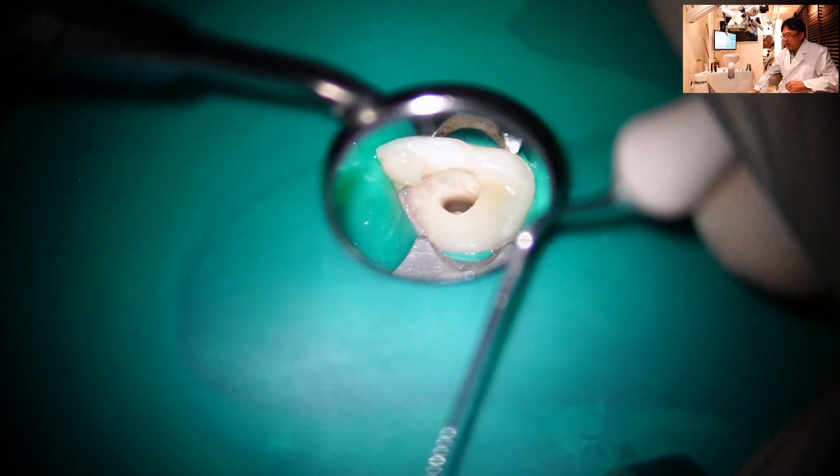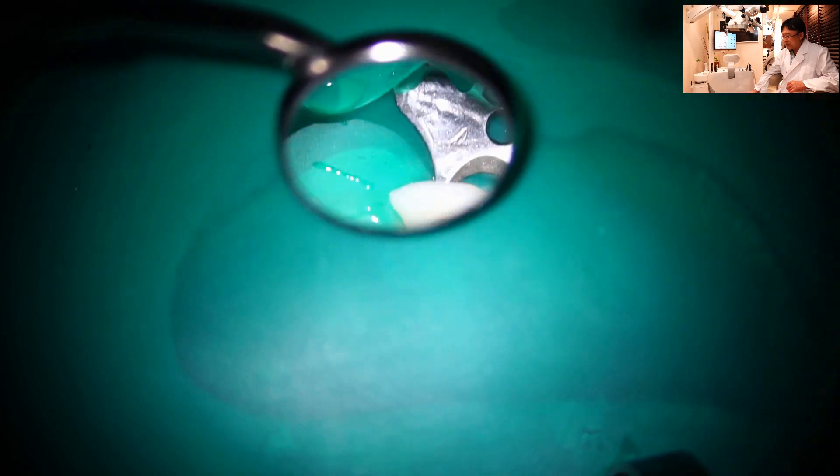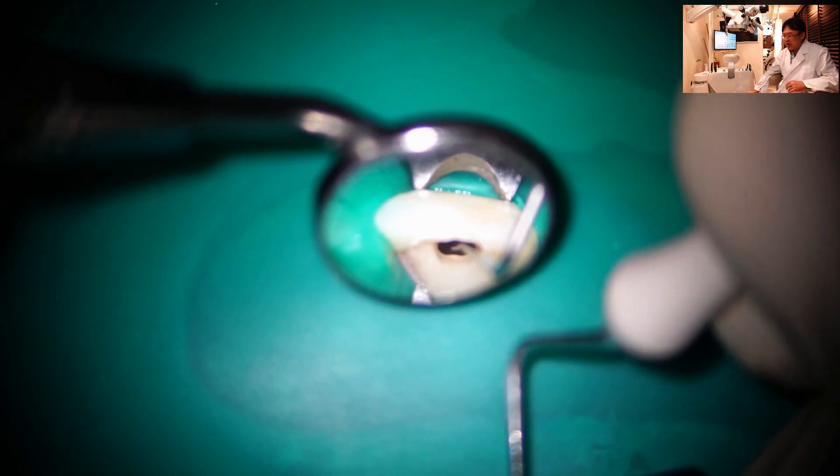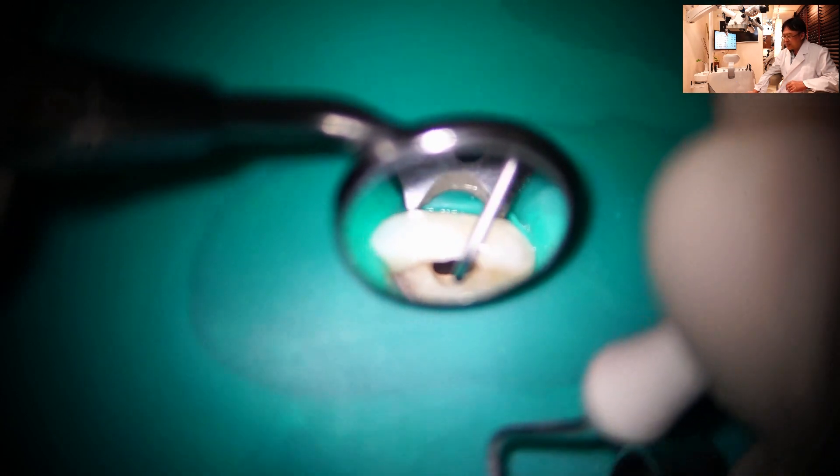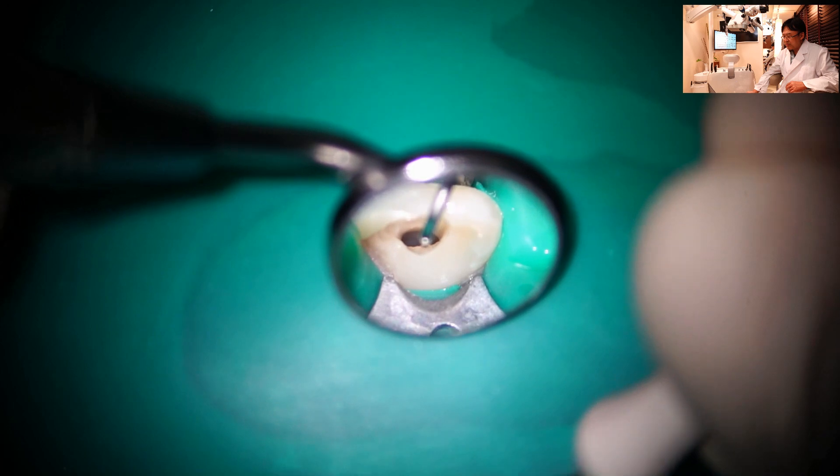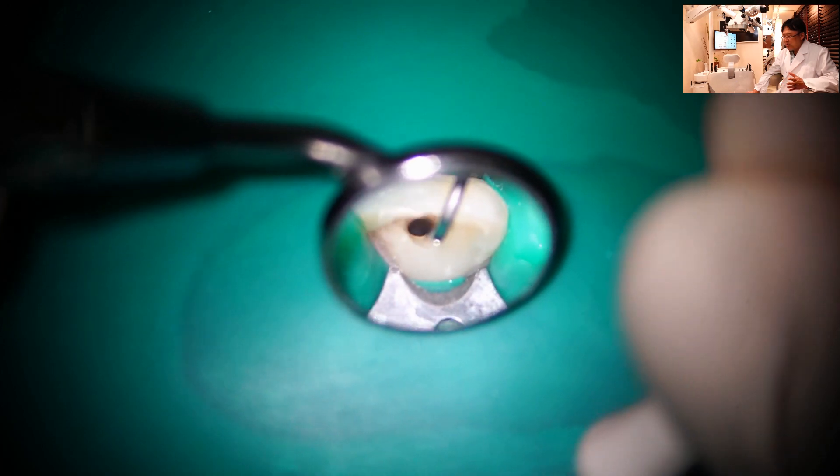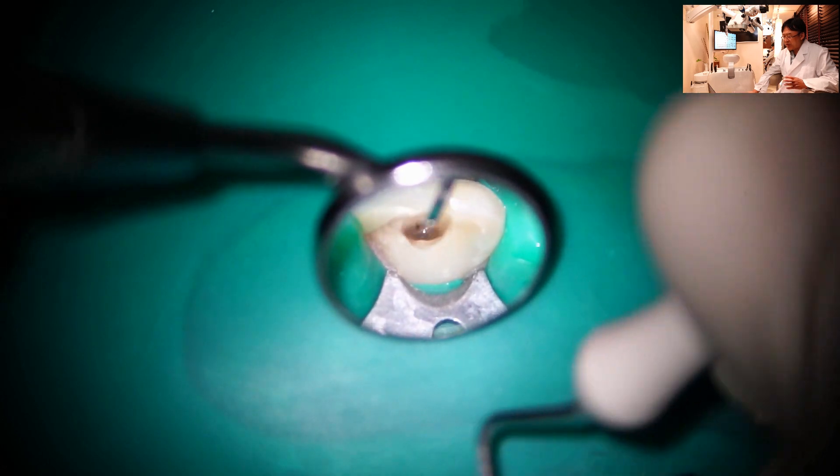So I'm removing the pulp tissues. As you can see there's no bleeding from the root canal. How are you doing? Is it okay? He said that I don't feel any pain. So that's good.